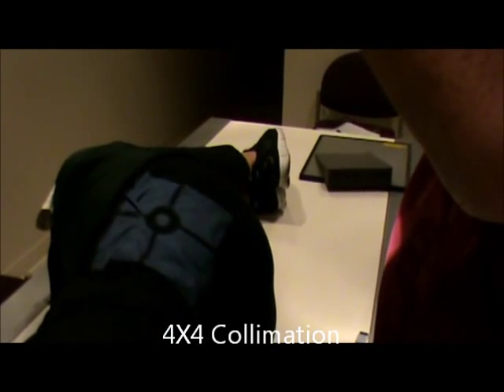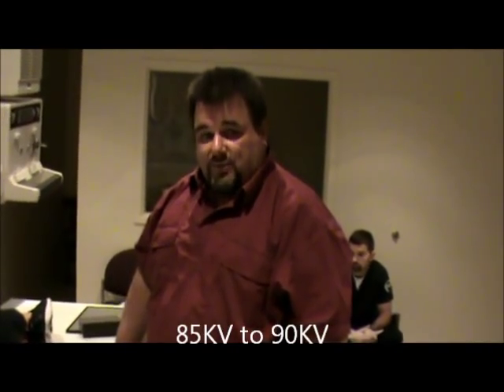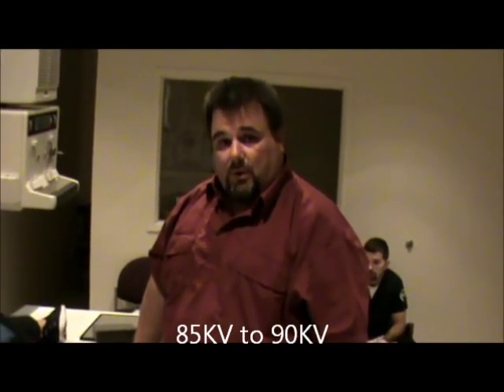Collimation for the spot film is going to be tight — about a 4 by 4. For marker placement, you can put it in a corner, or you can pull across and center to your film, place your marker there, and then re-center. What you're looking for on the spot film is the L5-S1 junction — that's what we're interested in. As far as technical factors, it does go up a little bit: 85 to 90 kV, center cell, automatic exposure control. This is our lumbar x-rays.